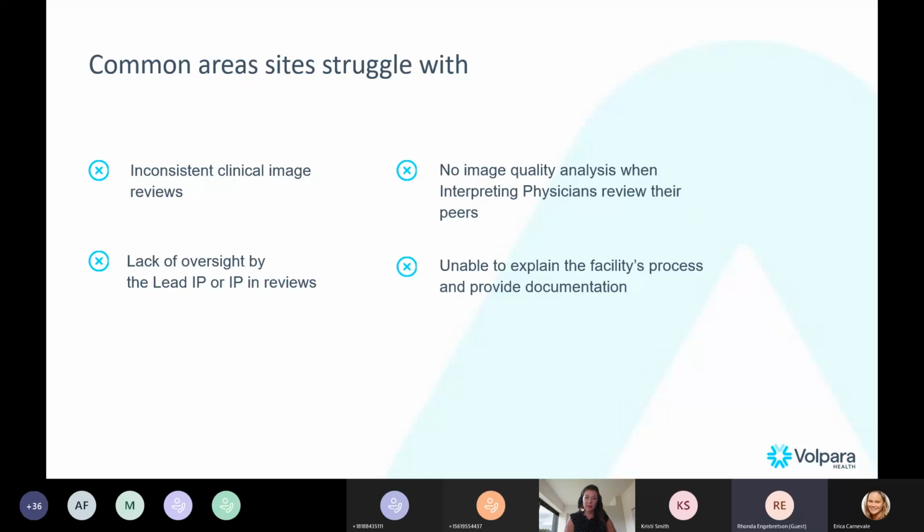Just because a lot of times, as humans, we're going to pick maybe a good exam always, because you don't want to give a bad review. It's subjective, right? We want to be able to review those images for the technologists and hope they're a good review.